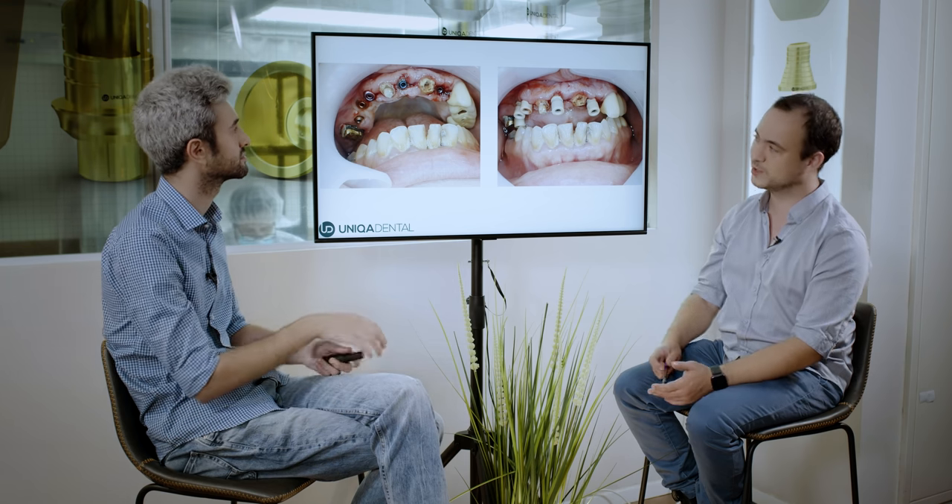The gingiva will heal, the implants will also integrate. We'll see how the gingiva healed, so we'll know in future parts what type of multi-units we should use and how we would design the crowns around the gingiva — to have a nice continuity between the gingiva and the teeth themselves. Here we see it after the implantation, after the removal of the cover screws. We chose the right multi-units for every implant by the height of the multi-unit. You can see the different colors of the multi-units indicating the different types available. You can see that one tooth has so much caries that even the core was removed with the bridge, which was cemented on temporary cement — these teeth are in really bad situation.